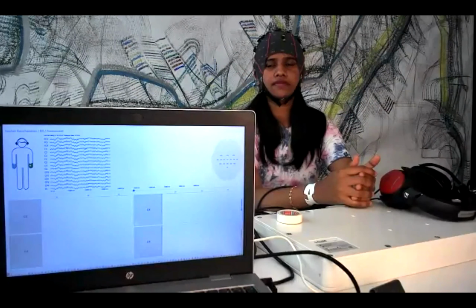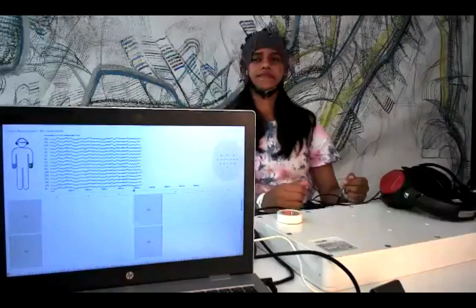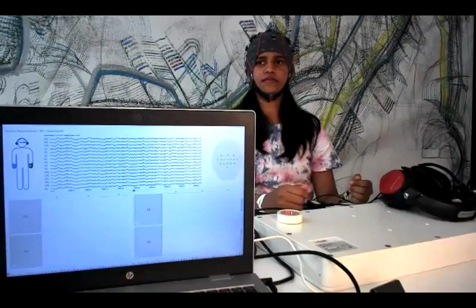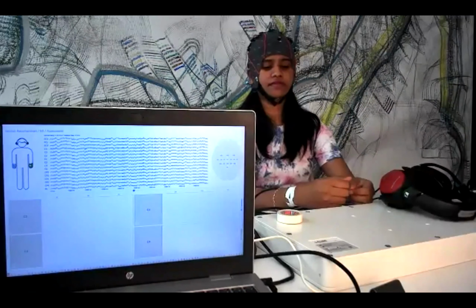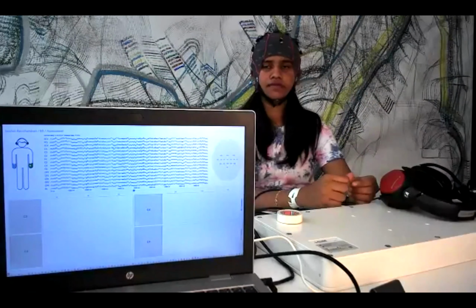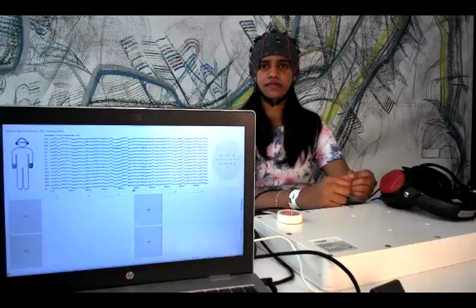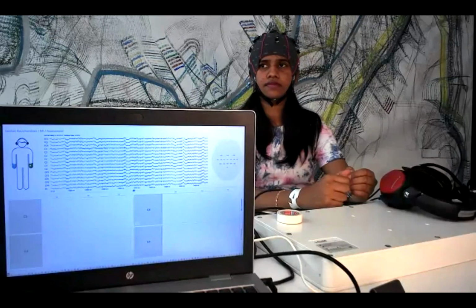Actually, in addition to the motor imagery, we also have a kind of precursor stimulation. So before the patient starts to imagine left and right hand movement, we give a short burst of vibrostimulation to indicate which side they should imagine. That's kind of a precursor. According to the previous study, this will improve the accuracy of the motor imagery.